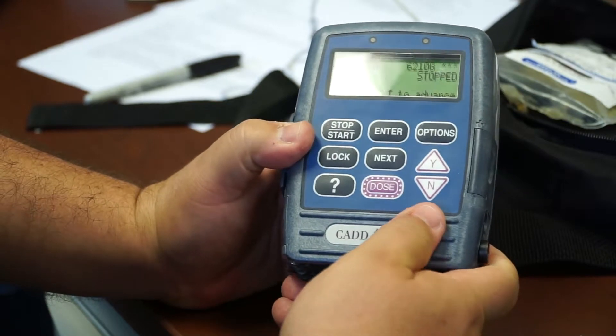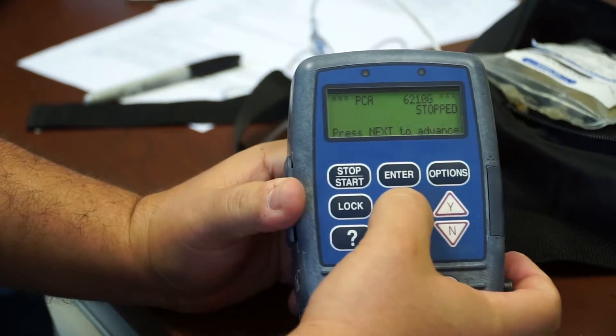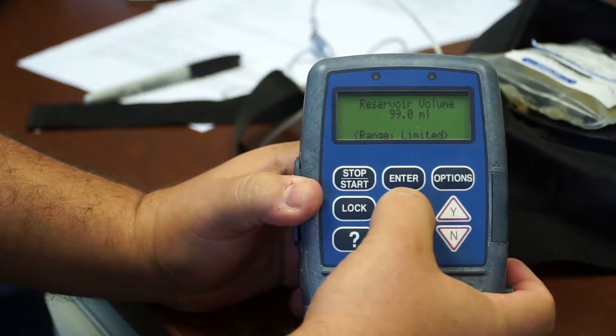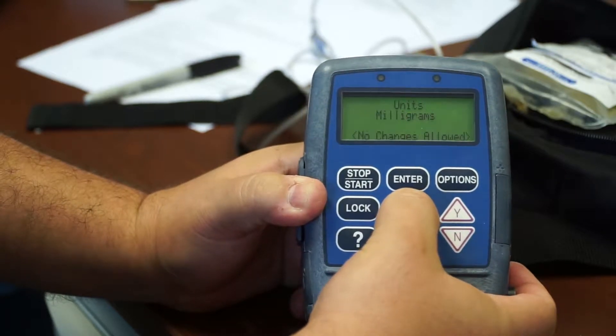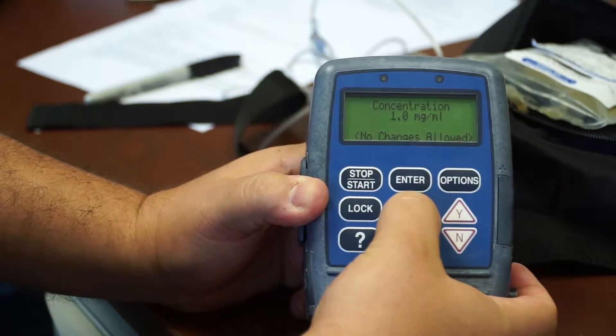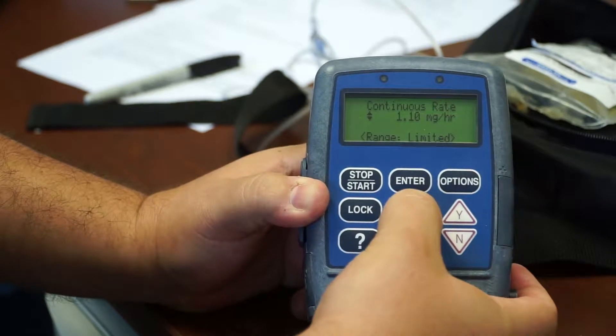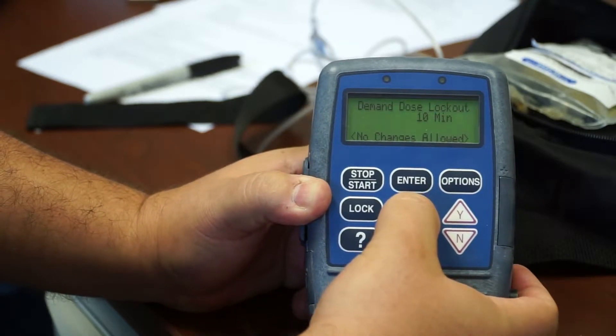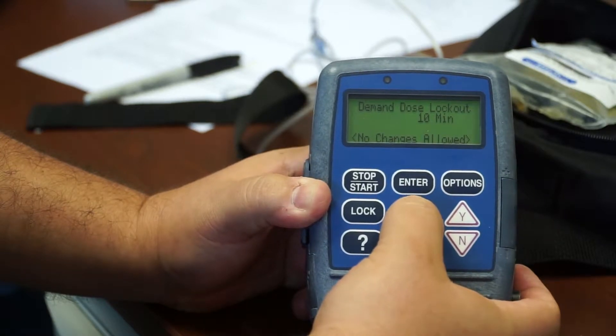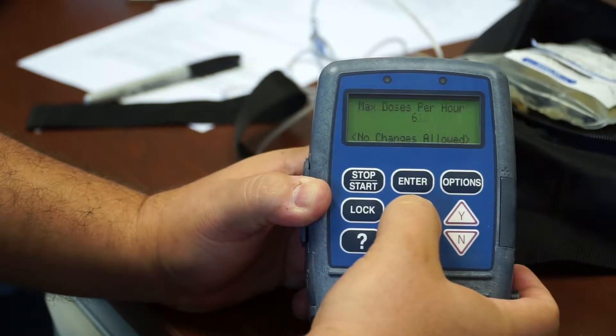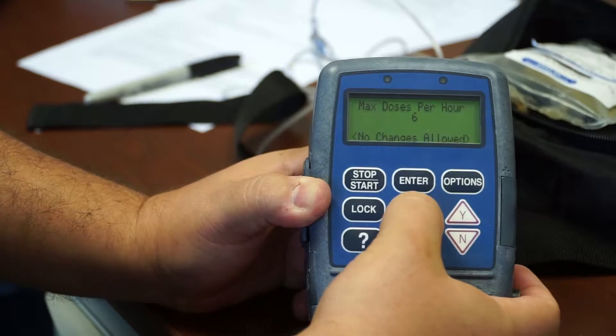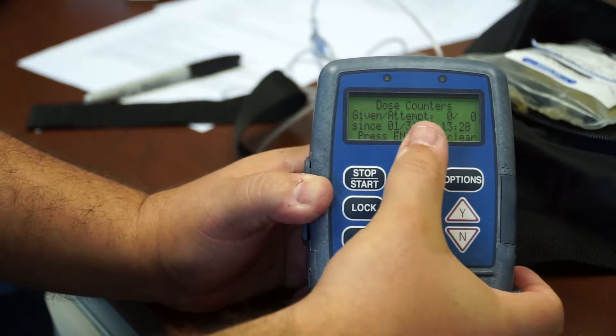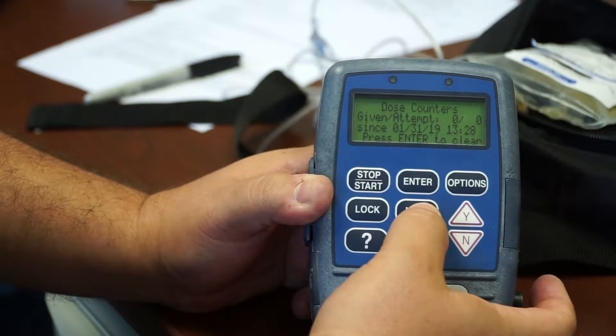So to look at the settings, you would click on next. And you could scroll through by continuously pressing next to see what your cassette settings are. See, it's your concentration, your rate, your demand dosage, the demand dosage lockout time, which is 10 minutes on this one, max dosages per hour.